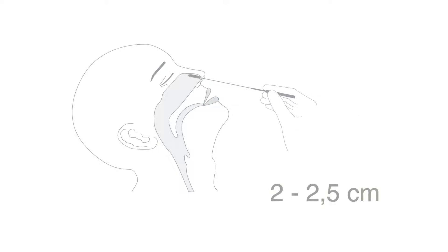When collecting a nasal swab, it is important to obtain as much secretion as possible. Before taking a swab from your nose, tilt your head back slightly. Insert the swab into the nostril as far as the turbinate bone, gently pushing it approximately 2 to 2.5 cm into the nostril until you meet resistance at the level of the turbinate bone.